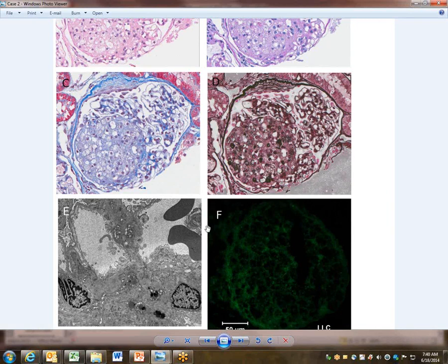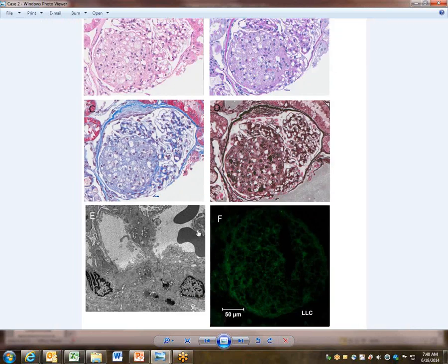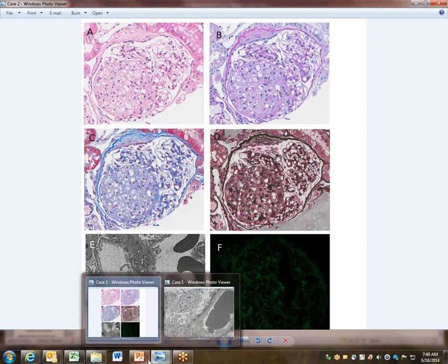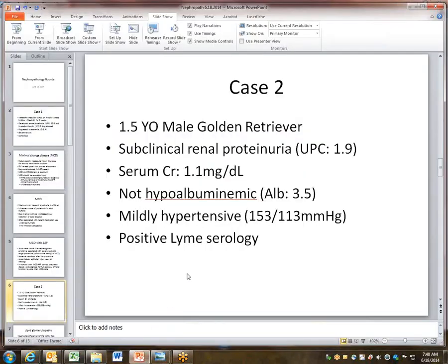So, okay. What's your diagnosis, Jeremy? So I think this is segmental glomerular lipidosis. And your comment in your previous report that you wrote to Dr. Baden, I dropped your name and said that previously you had said that you're thinking it's kind of a variant of focal segmental glomerulosclerosis. Yeah. So I think we can move to the PowerPoint, and I think you did a really good description.